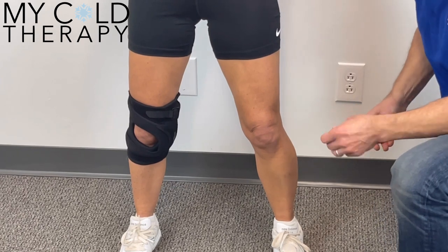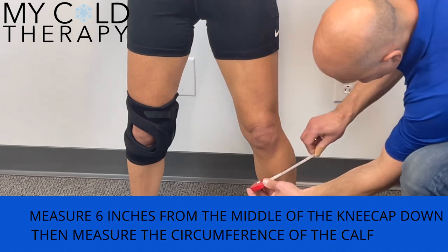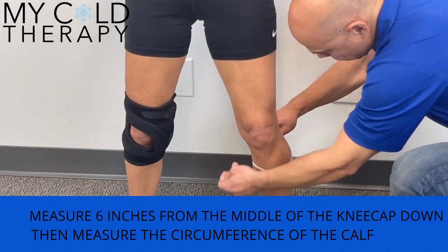The next measurement is going to be 6 inches from the middle of the kneecap down, and then you get a measurement around the calf.